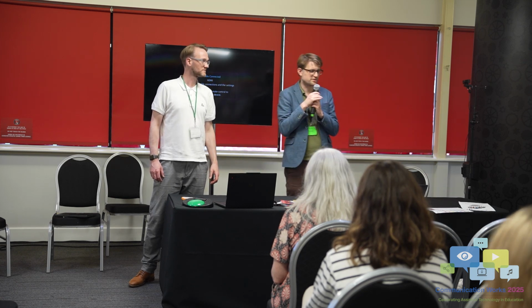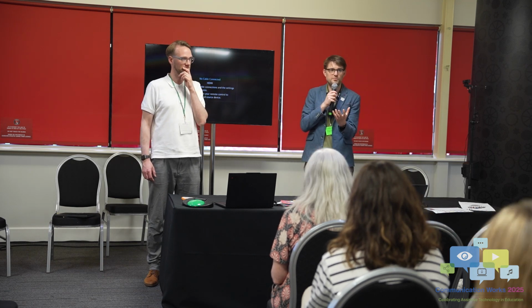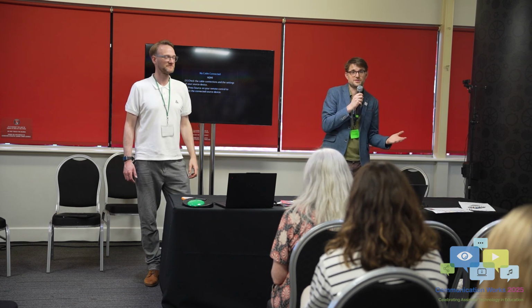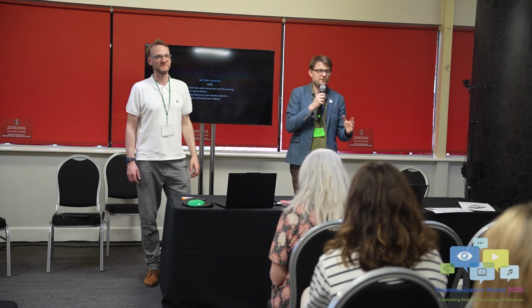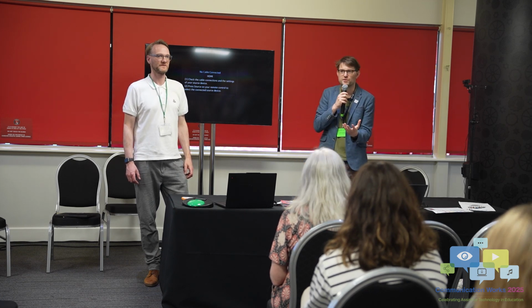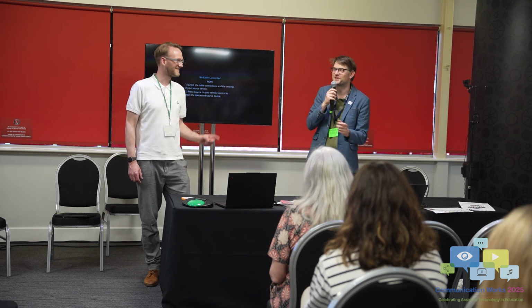You can get switches that light up as well, to help people, but we try to take the focus away from the switch. The switch should just be a movement that happens to press something, which creates access to the world. If we make the switch too exciting, then people will just focus on the switch, which is not what we want. But sometimes we need to do that in order to prime the pump. Thank you, Luke, for this phrase.